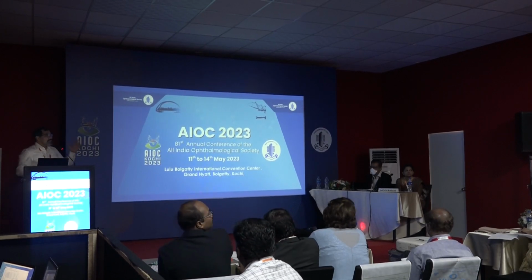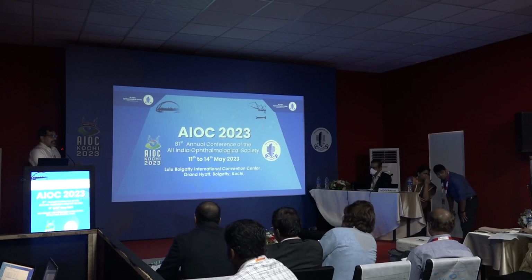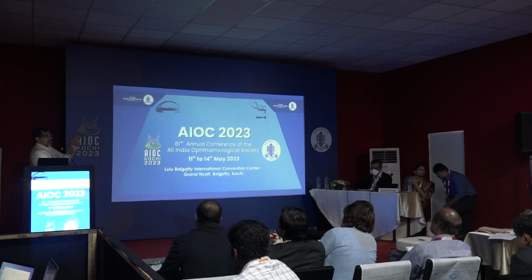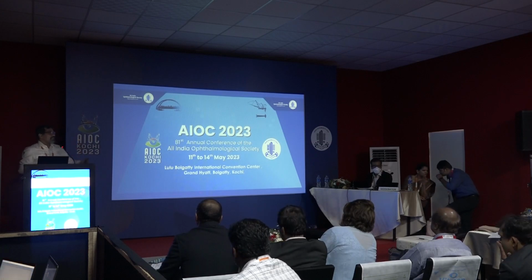Sometimes you can take the tablet with you in the OT. After you have put the toric lens, you see which structure you are able to see and which is there in the topography picture. You tap on it, and it will tell you this is the location. So you mark this point, and these are the reference marks.